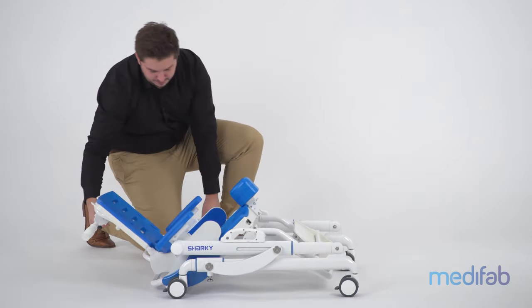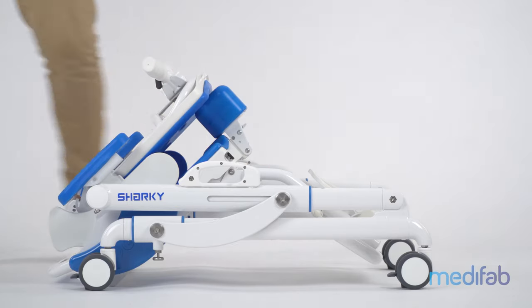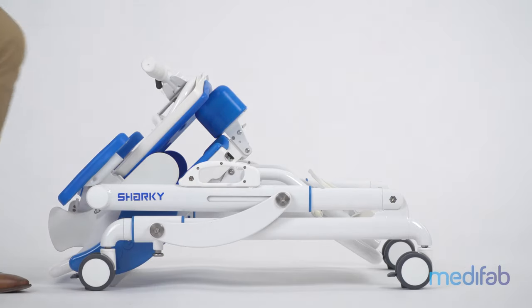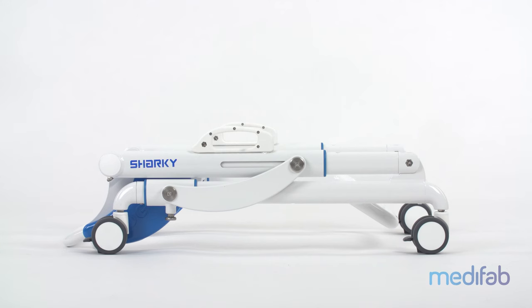Finally, fold down the back for the smallest size for storage. Do not forget to re-engage the locking pin at the end of the process. By detaching the seat unit before folding, an even smaller folded size can be obtained.